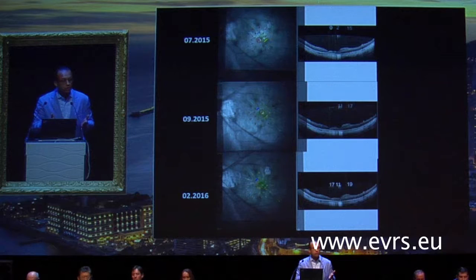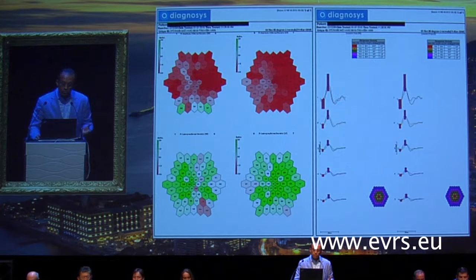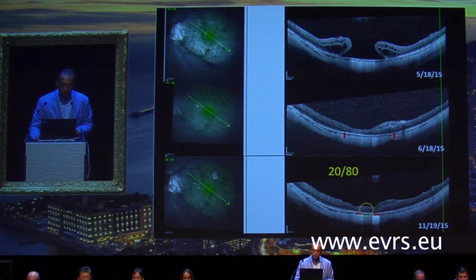Also, I wanted to know exactly where this is coming from, so we have a software where we can do co-localization of the microperimetry exactly at the same scans on subsequent visits. And when you look here at the areas and the numbers as it improves, it is at the edge of the old retina, but it is also over the area of the transplant. Also, the multifocal ERG waves were very similar. It's still a crude test, but at least it tries to show some functional changes.